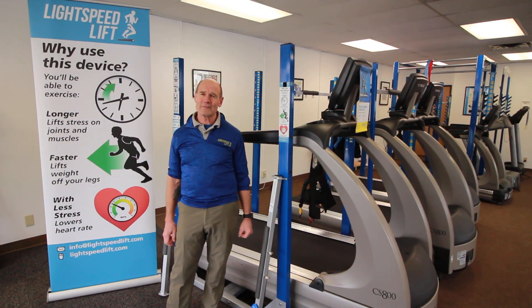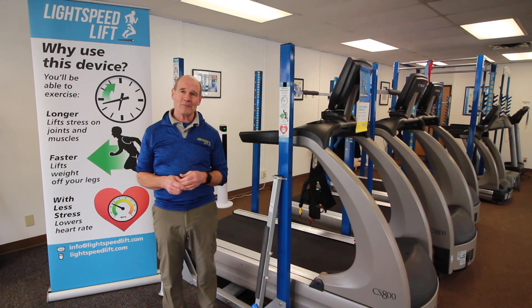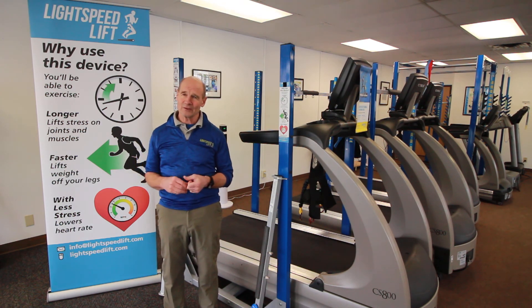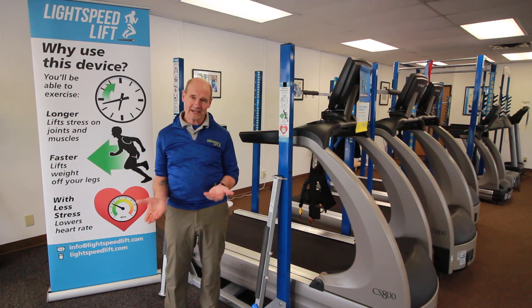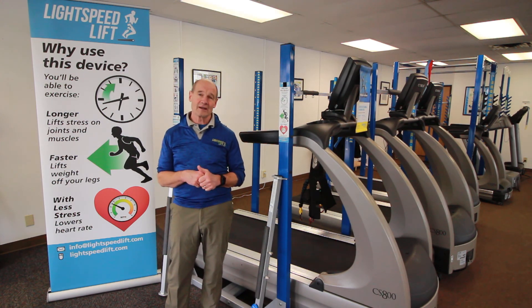Well hello! Welcome to Chapter 2 of the Lightspeed Lift Story. In Chapter 1 we talked about why Lightspeed came to be — a body weight support system that was effective at taking off weight, was efficient to put on, and was economical.